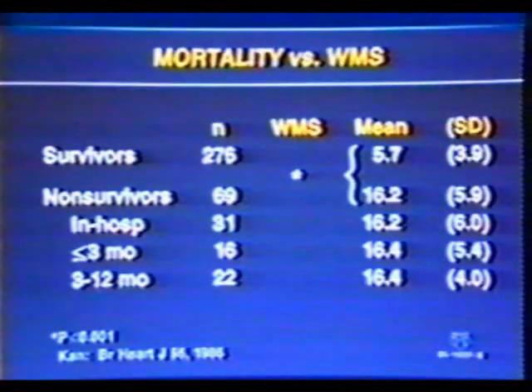Dr. Kan and his colleagues in the Netherlands used echocardiography to obtain wall motion scores for 345 patients shortly after they were admitted with acute myocardial infarction. They utilized a different convention for scoring wall motion, which explains why the scores which they reported differ greatly from the score indexes which we have utilized. Nevertheless, the basic principle holds that higher wall motion scores are predictive of complications.